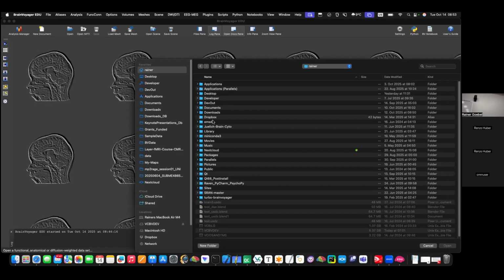And then you download the link. It's part of the download links I sent you. It's 1 kilobyte, a very tiny file. It's in an email, ending with .bin.zip. Yes, the one you showed under "for Windows do this", there's just the bin file. That's the one. If you have it, grab it and put it into BrainVoyager. Then you need to unzip it first, otherwise nothing happens.